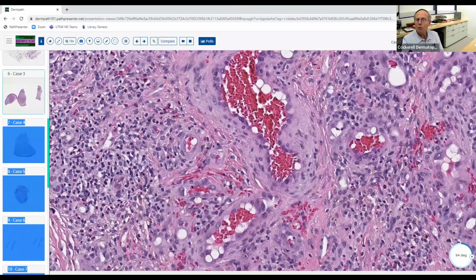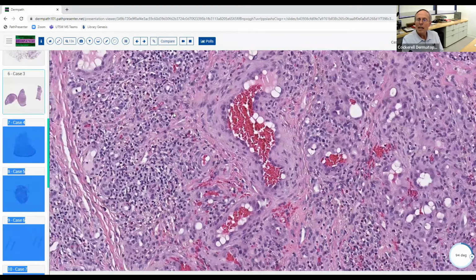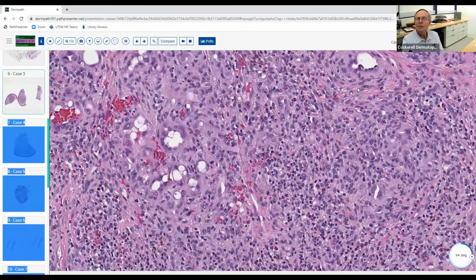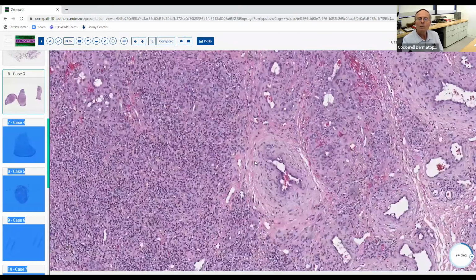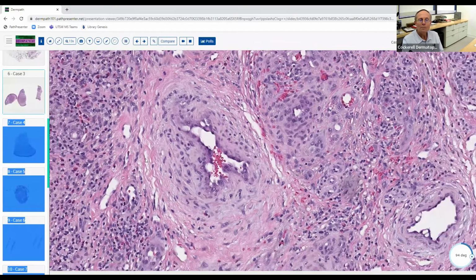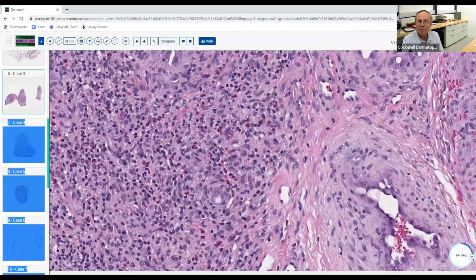And notice, you're totally correct that these are vacuolations inside these endothelial cells. And notice how prominent the endothelial cells are. They're protruding into the lumen of the individual blood vessels. And then look at the wall of these blood vessels. Notice how thick-walled this is. And then there's one other clue to the diagnosis here. What kind of cells do we have in the infiltrate?